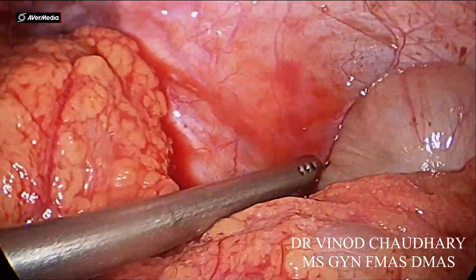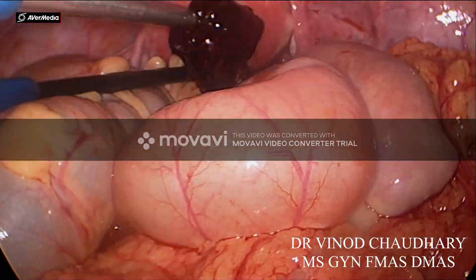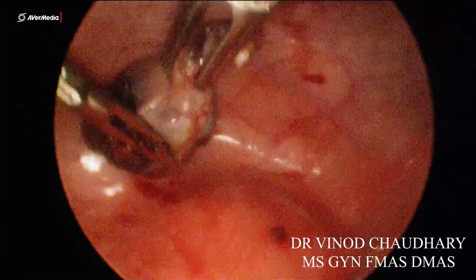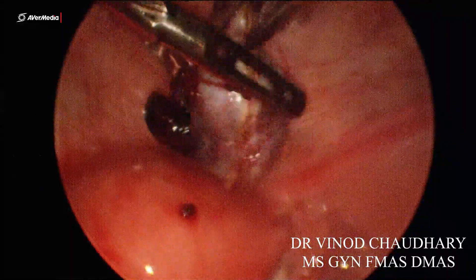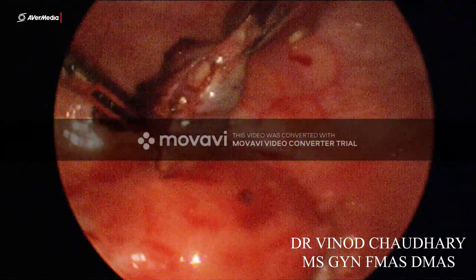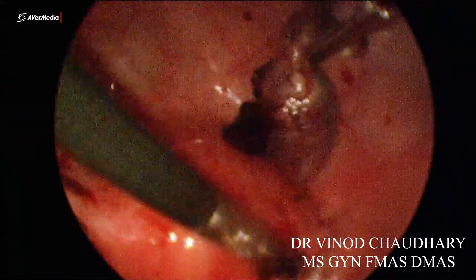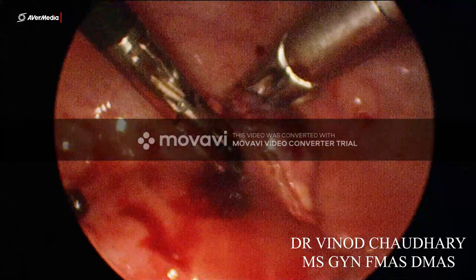We have only used 100 ml of diluted heparin and 300 to 400 ml of normal saline for the cleanup. This is the ectopic we are taking out — it was a little large in size, so it was difficult to take it out whole. We removed the inside part: the decidua and the blood clots. We used a 5 mm and 4 mm trocar and introduced a claw forceps from the primary camera port which is 10 mm.